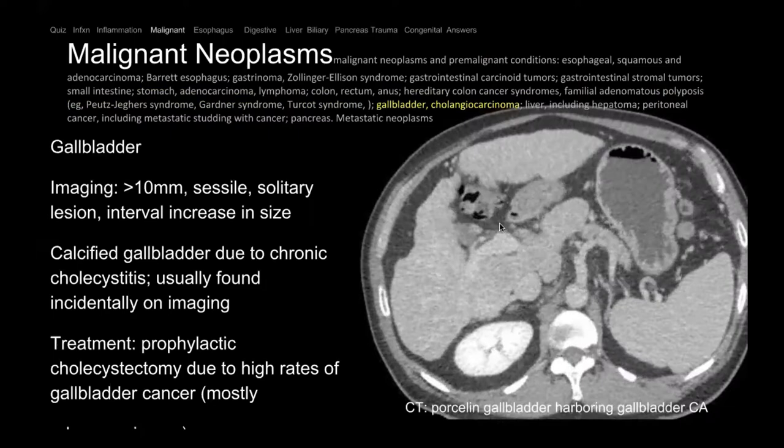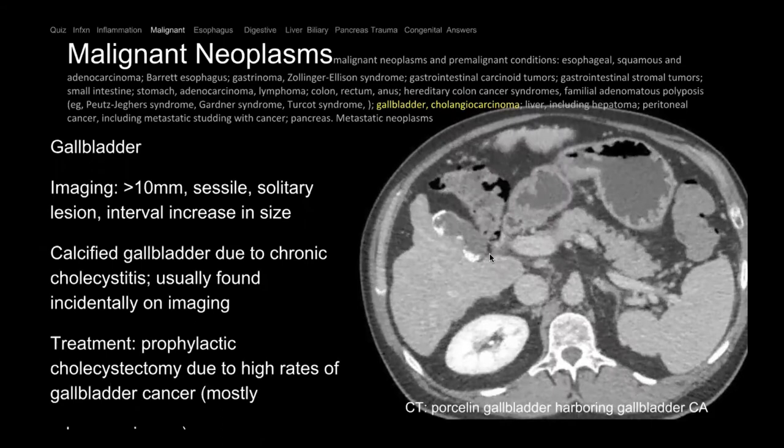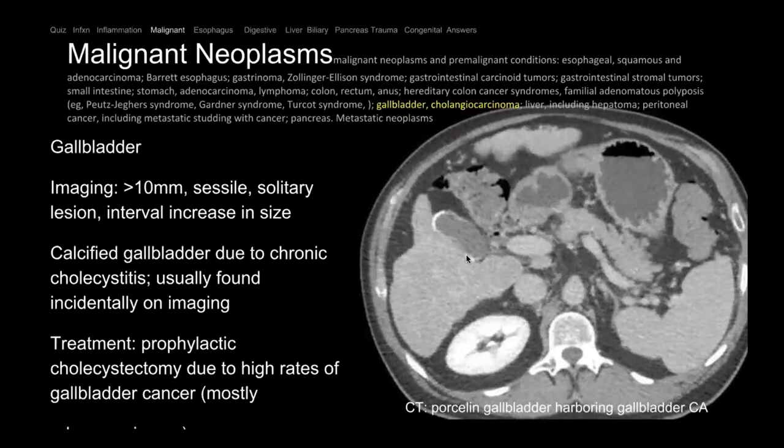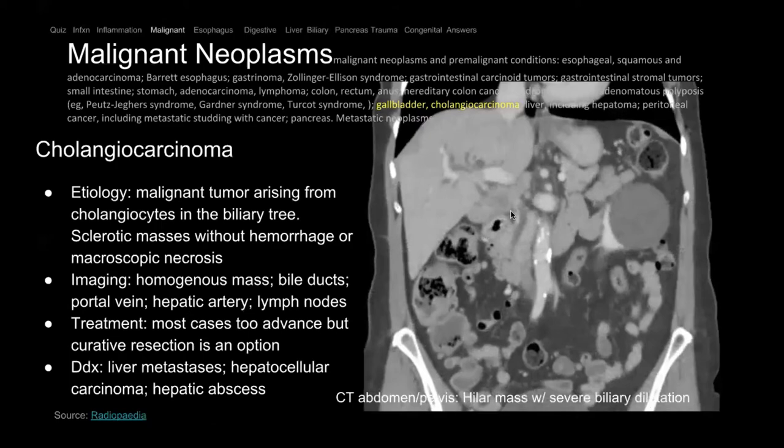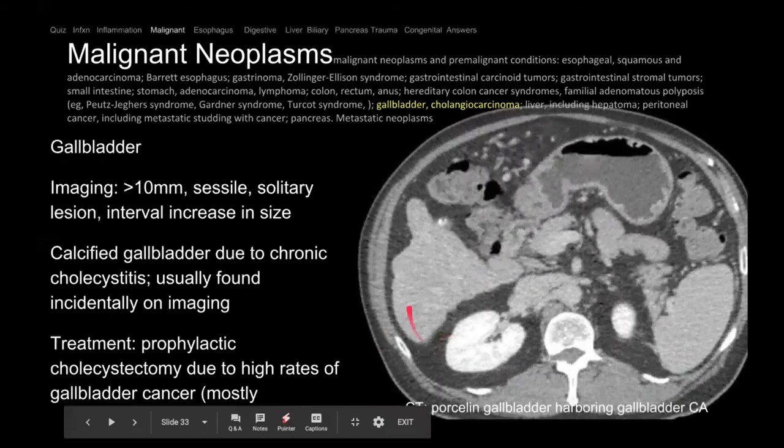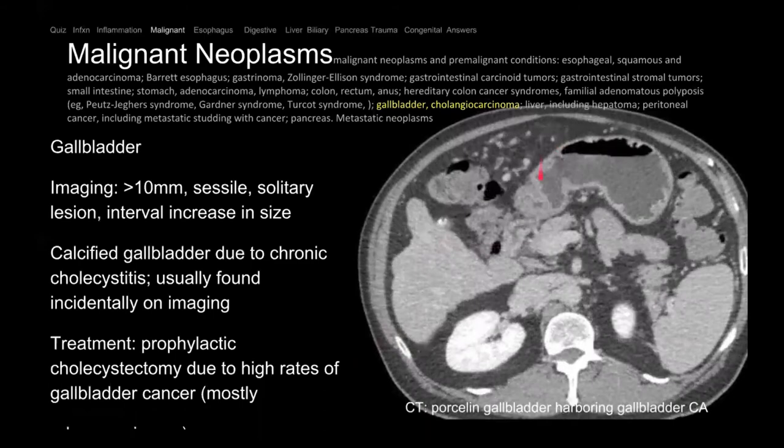Here on CT we see calcifications along the gallbladder wall — this is called the porcelain gallbladder. Patients with porcelain gallbladder are at increased risk for gallbladder cancer. The background liver is also abnormal — nodular and shrunken — so the patient has background cirrhosis, which increases risk of HCC. The gallbladder was resected and contained gallbladder cancer.